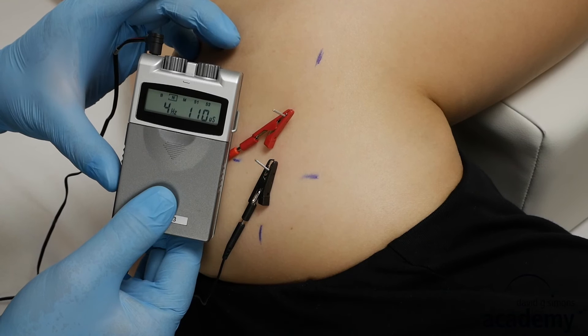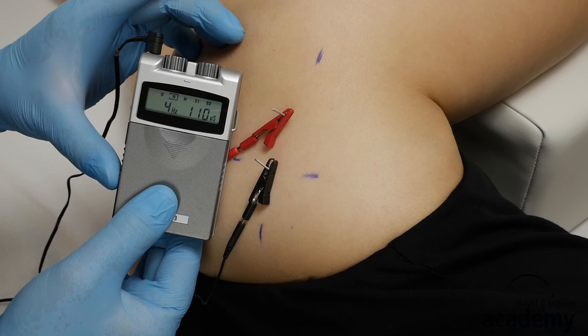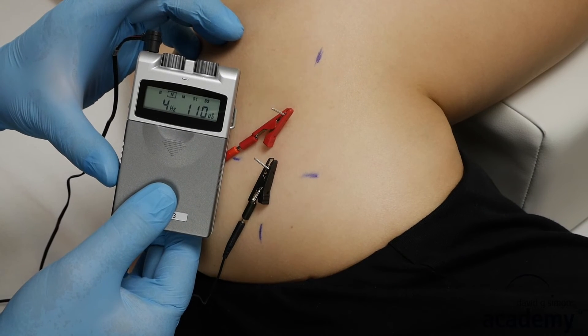Depending on the number of output channels of your TENS device, you can treat several taut bands at once. Remember to palpate and mark them first.